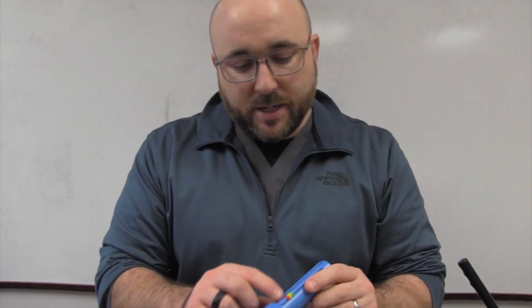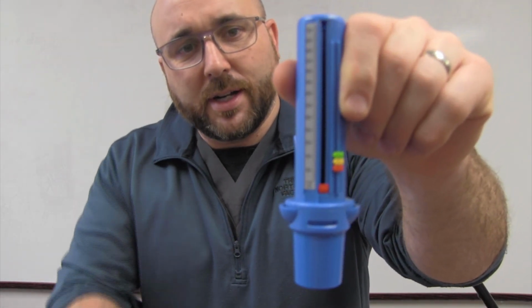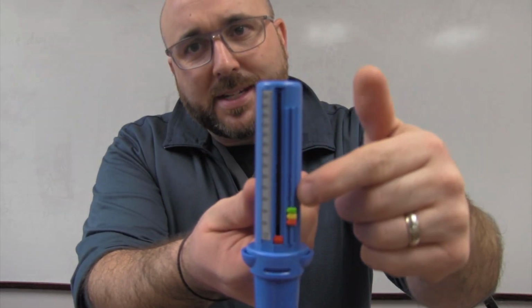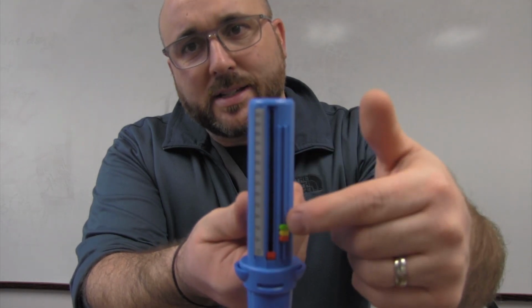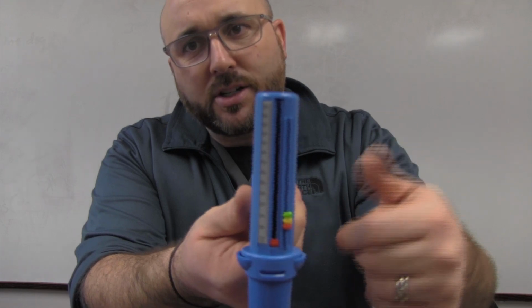Peak flow is the fastest speed you can blow out. So you're going to see this right here on the monitor, and you're also going to see numbers going up this side. The little red one right there is going to measure your peak flow. So you see your numbers, your peak flow. These little guys, we're going to show those in a second.